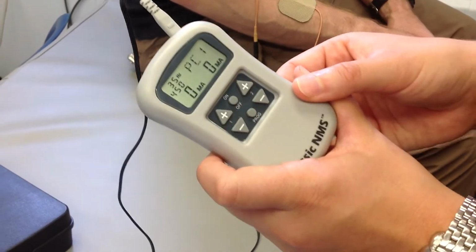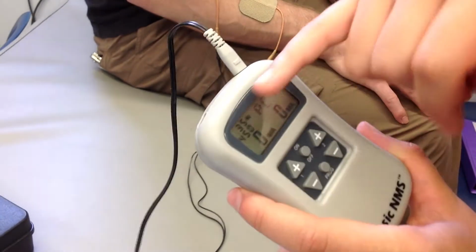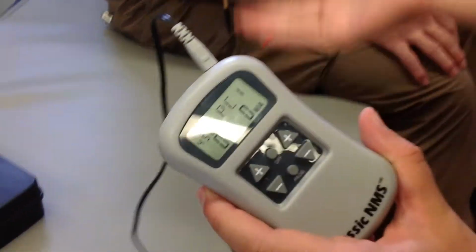Set button. In order to change, that's for 35. So then you hit set again, and you could change the microseconds. For slow contraction, you would do 450.